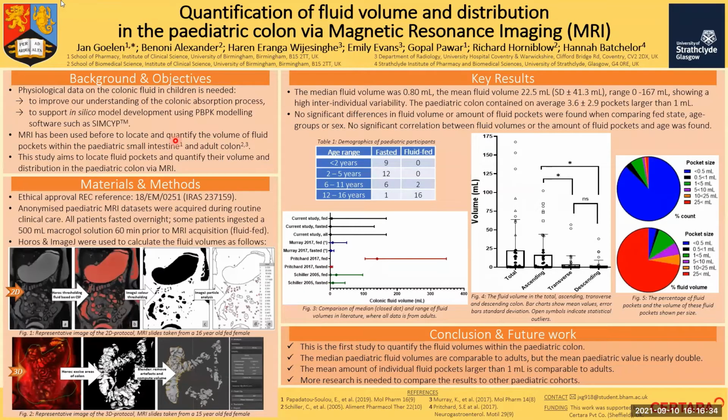Thank you for attending my poster on fluid volumes within the paediatric colon. So a little bit of background. We need physiological data on colonic fluid volumes in children, both to improve our understanding of the colonic absorption process, but also to improve our current models for colonic absorption, so we can make these models more biorelevant.